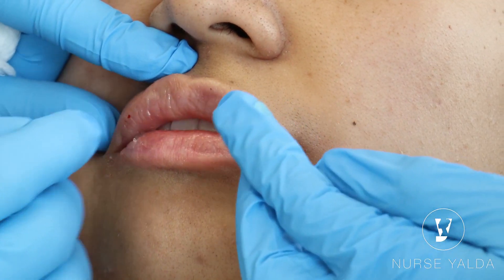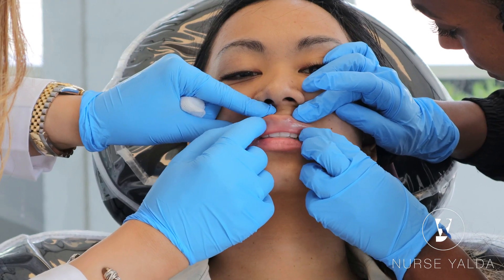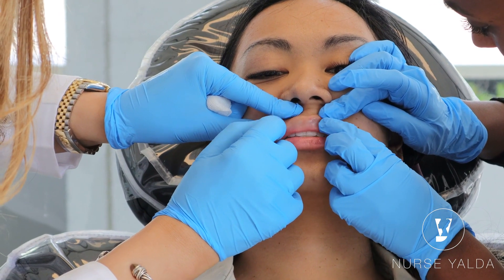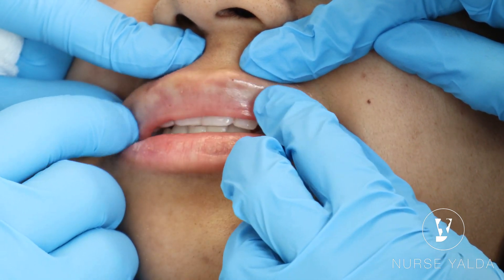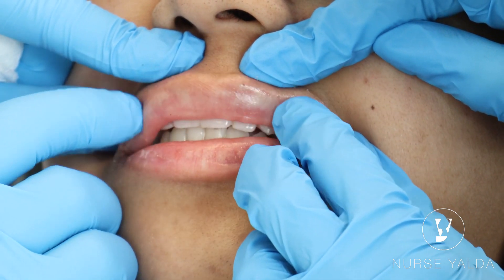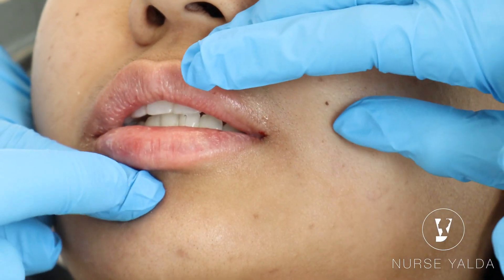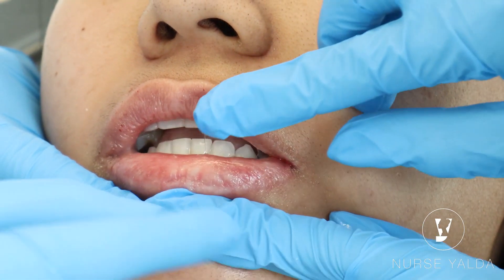It gives you a little scratch-scratch sensation, so hold it with your non-dominant finger. Make sure it's nice and gentle, nice and smooth. The same thing from the bottom — put your finger here so you have control.